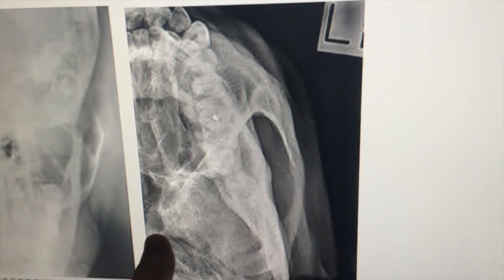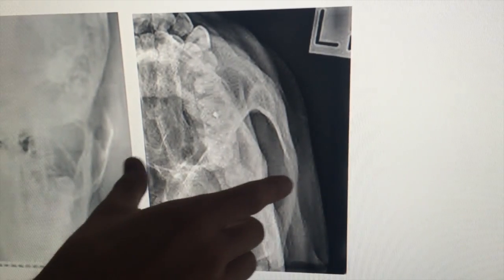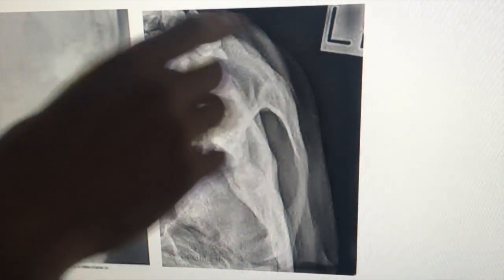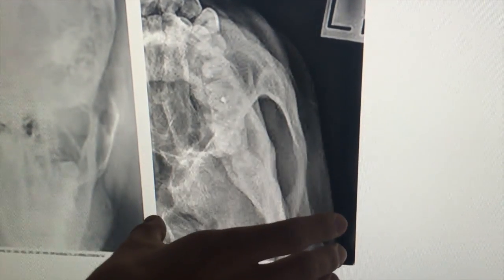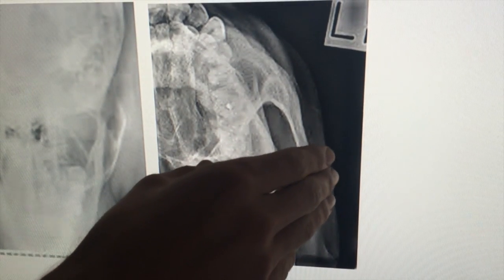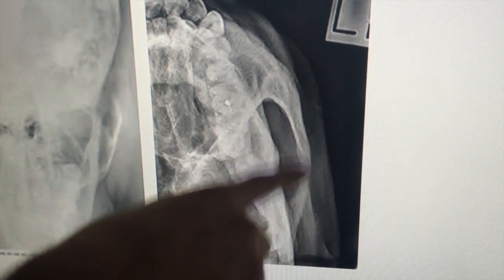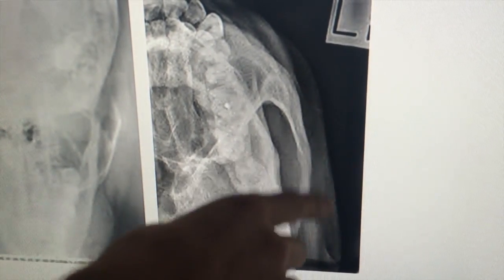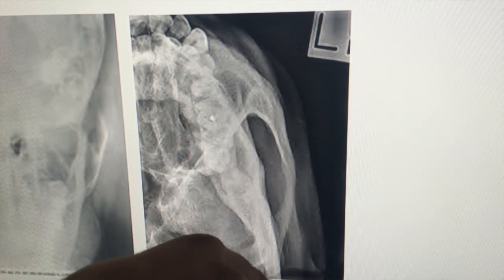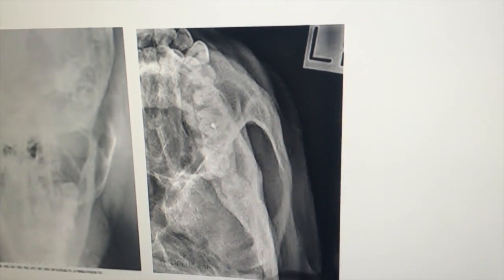And then we have our tangential, the double 15. The zygomatic arch is free of superimposition of anything. We have good collimation because we include the entire arch. And then we didn't overexpose and burn it out. We actually see some of the cheek, so we did pretty good on our technique. We have our marker, good collimation. So those are our images for the zygomatic arches.